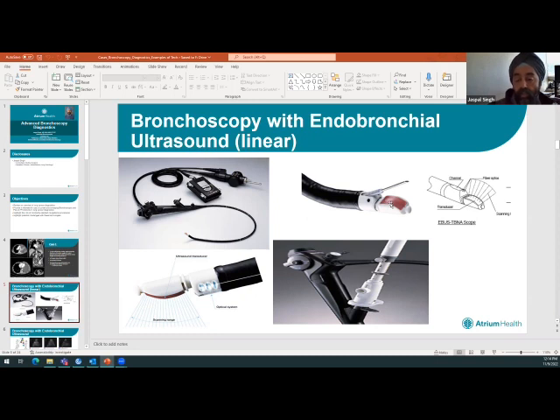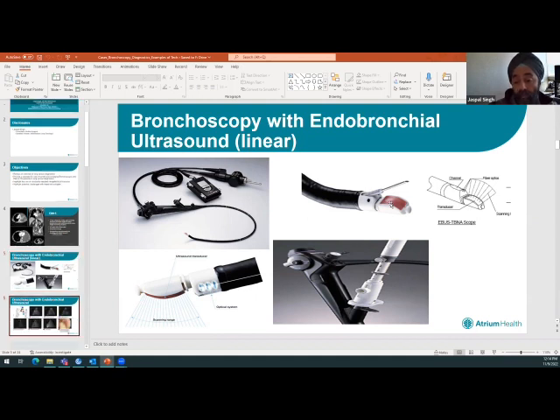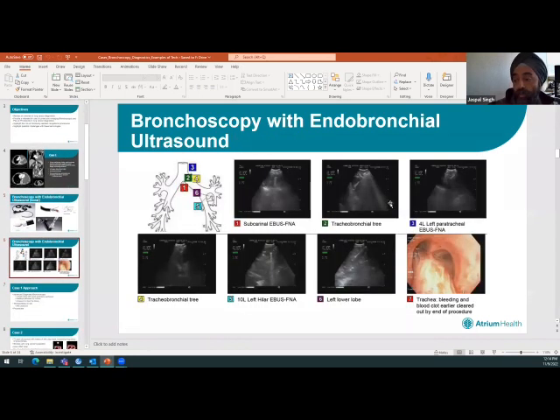And that last patient, that lesion was central enough that we could get to the airway close to it. In traditional tools, the airway looked normal, but now I can see behind the airway and biopsy the lung mass itself. And so this is what we would normally see. We would come in this area right here, and normally when I look on the inside, I don't see anything besides a main left lung, right main lung.